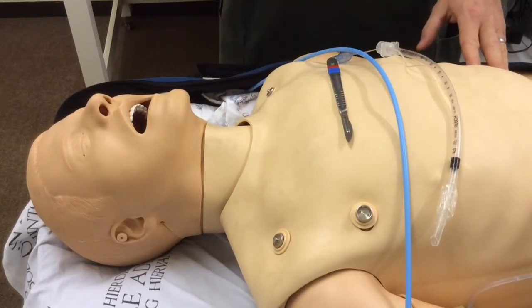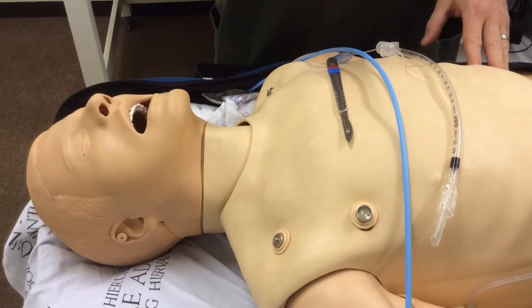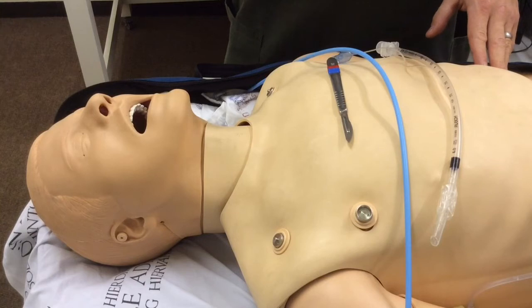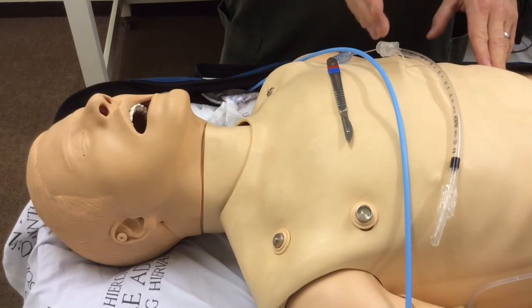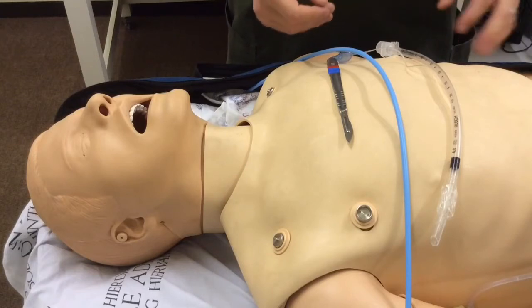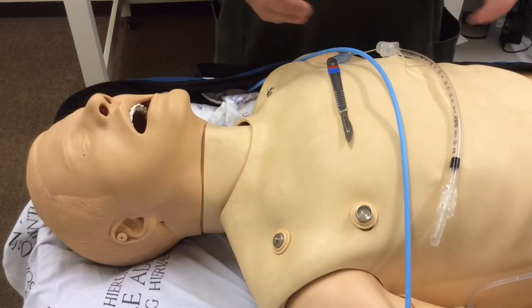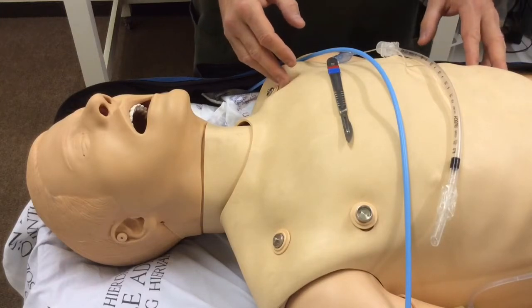The equipment I need for this procedure: I'm going to need a scalpel — DAS recommend a size 10 blade, but use what you have immediately at hand. I'm going to need a bougie; you want a coude-tipped bougie, and preferably a hollow core bougie if you've got it so that you can oxygenate as an intermediate step if necessary. And you want a size 6 standard endotracheal tube immediately at hand.